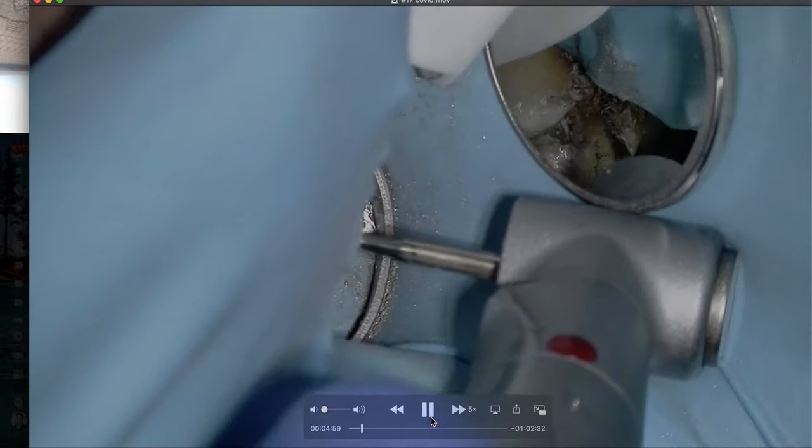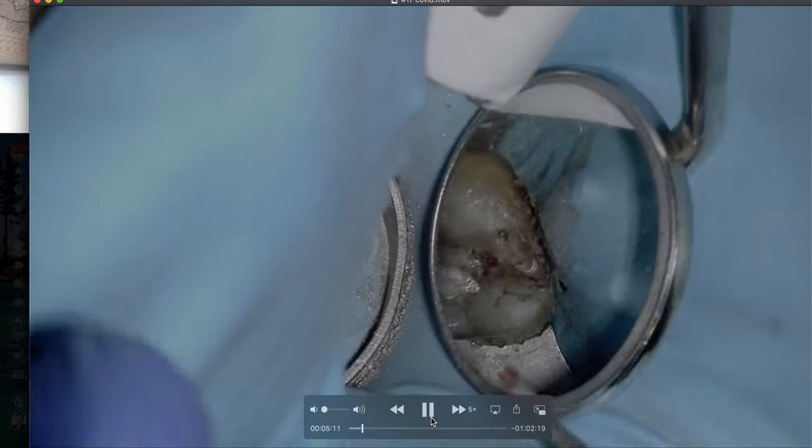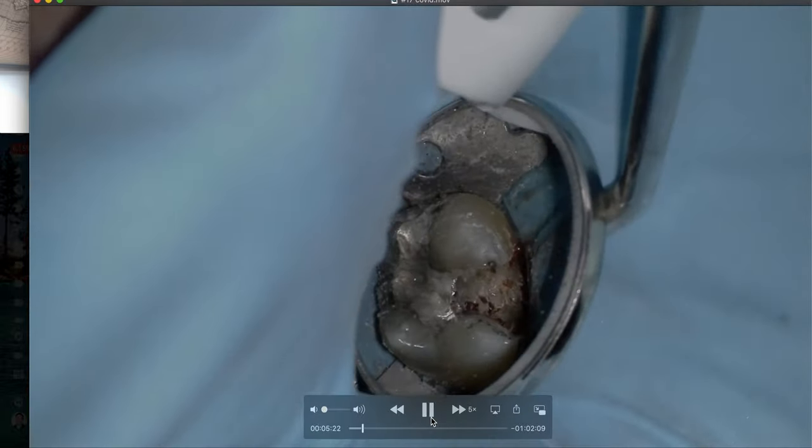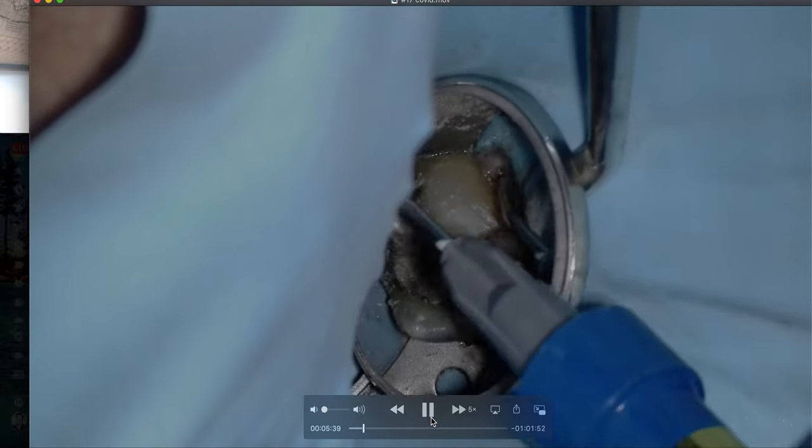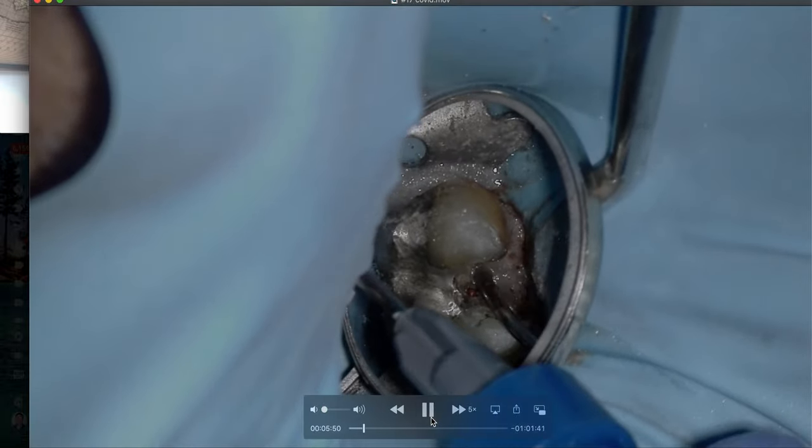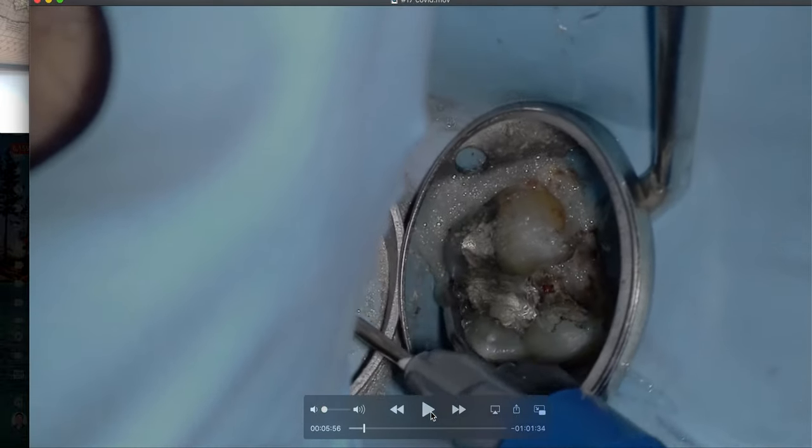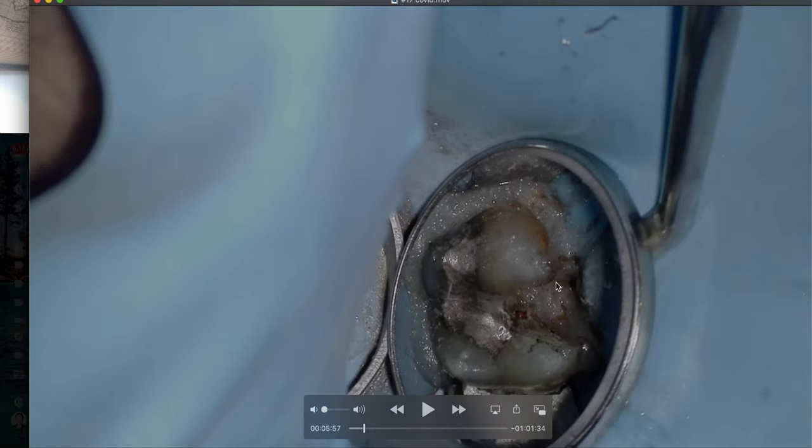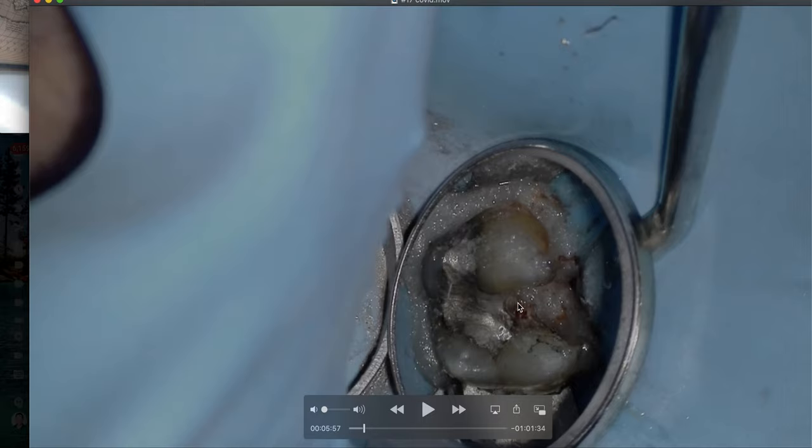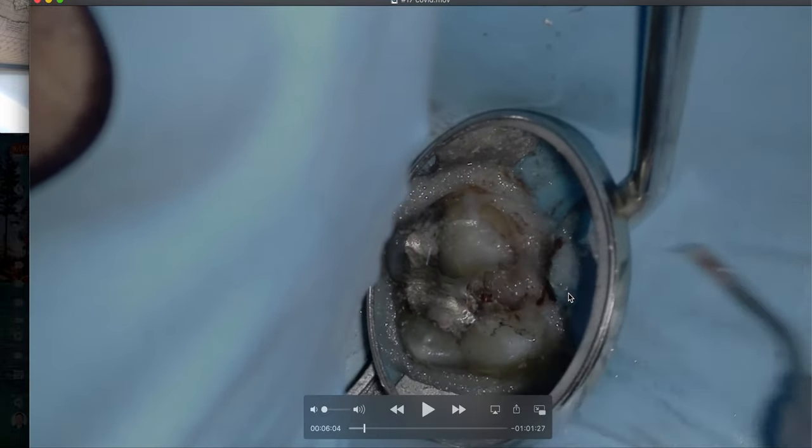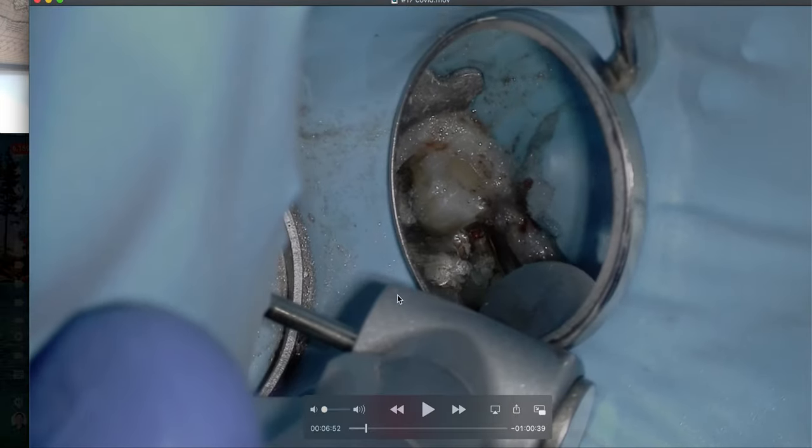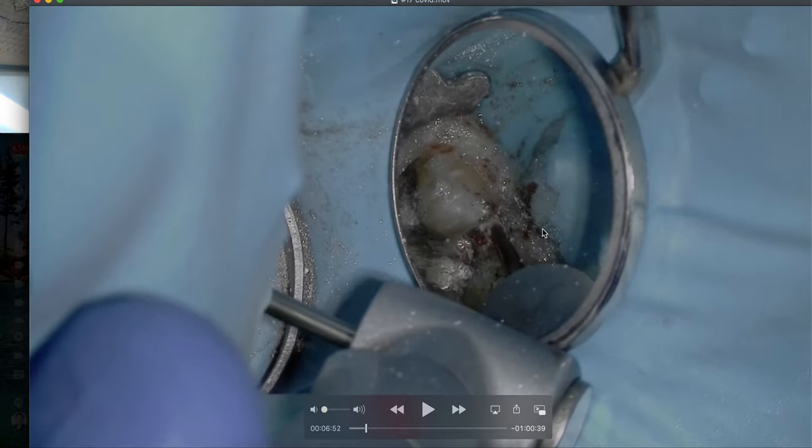We're going to remove any more of the decay out of that area. And then what we're going to do is we're still going to remove any decay. Then we're going to switch to a number two round. And we're going to go into the pulp chamber. So just before we do that, we're going to reapply our secondary seal. So what happens is it flows all over the place here. Sometimes it flows all over the place. What we're going to do is I'm going to actually use a number two round or a number four and just remove this.